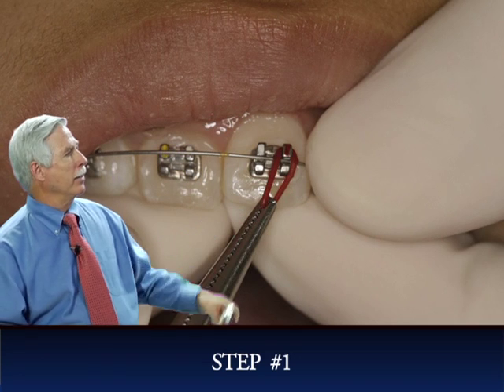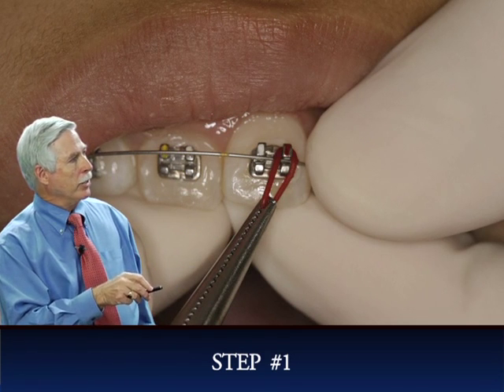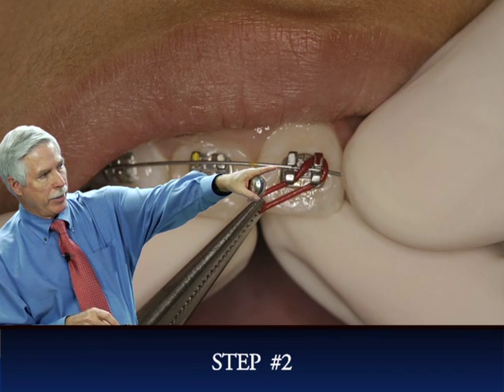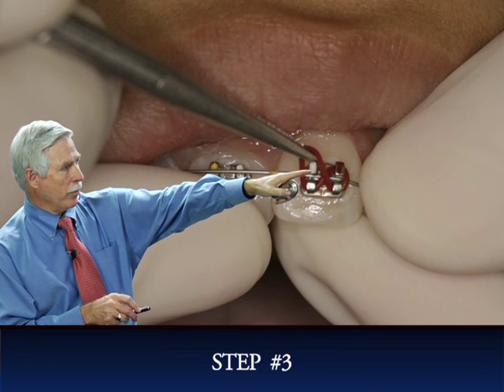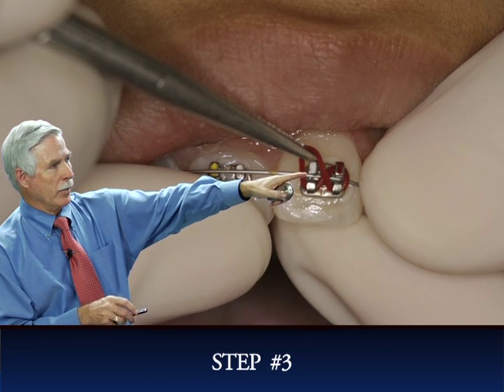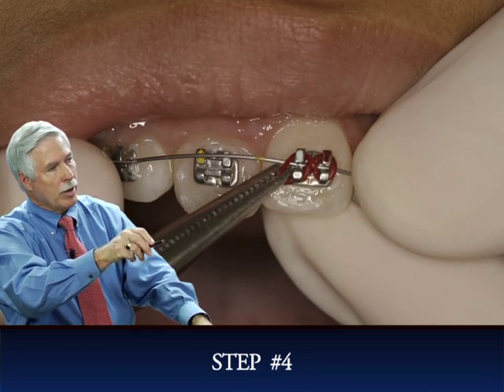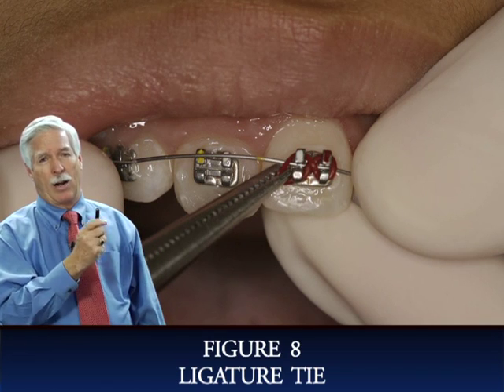So you can see, step 1 is you place the Sani tie or donut around the 2 distal wings of the bracket. And then in step number 2, you slide that underneath the 3rd distal wing over here. And step number 3, we move it up over that distal wing. And now it covers, you can see, it's a figure 8. We call it a figure 8, and we call it double tying, and that really socks that wire into the bracket slot.